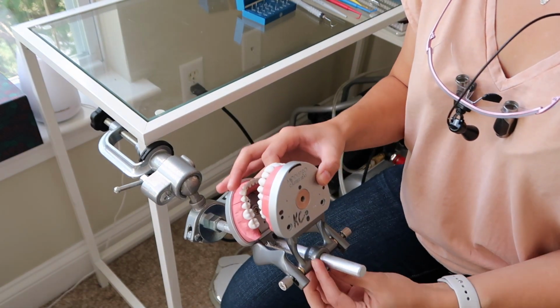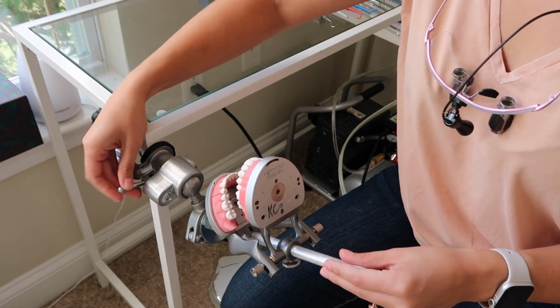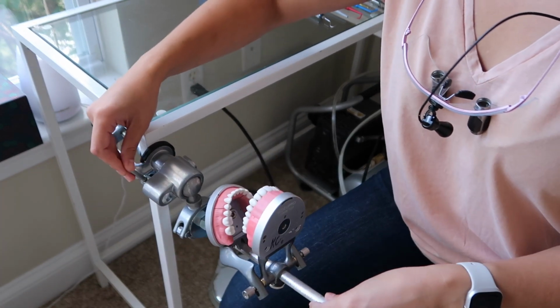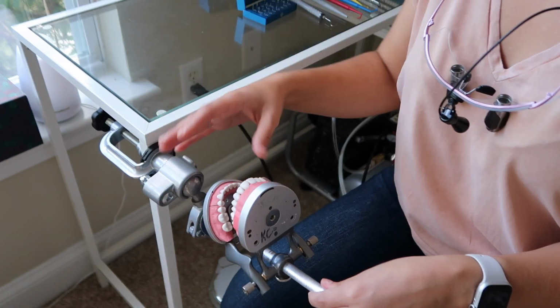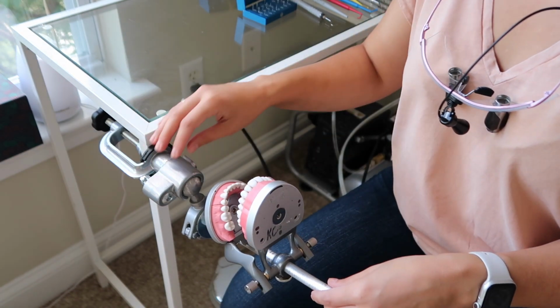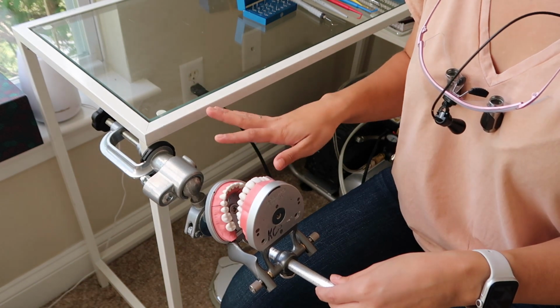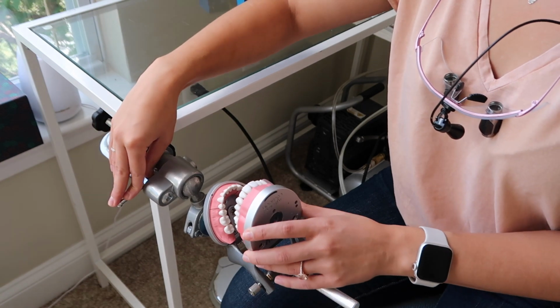It's attached over here. And I'm prepping an upper tooth today, so it needs to be as low as you can possibly make it. So it just adjusts like this, and you can move it left or right any way you want. It's just a ball joint over here, so it's really movable. The only thing is that there is no face on here. There are no lips and cheeks, which is not really a problem for me. I have had enough practice with that in school. This is just kind of to learn how to prep, not on a bench top, and this does a great job. I haven't looked for mounting poles with the face, but I think it's just too much.